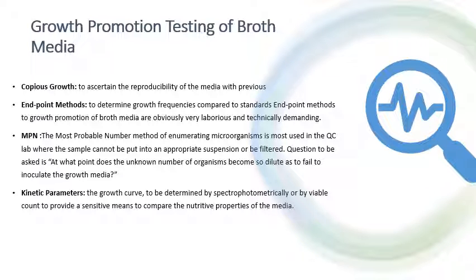While the kinetic parameters growth curve allows us to determine how the organism grows per time, and this is measured through the use of a spectrophotometer that allows us to determine the turbidity and interpret it on a growth curve that is plotted on a graph. So the kinetics parameter is started at 0 time.